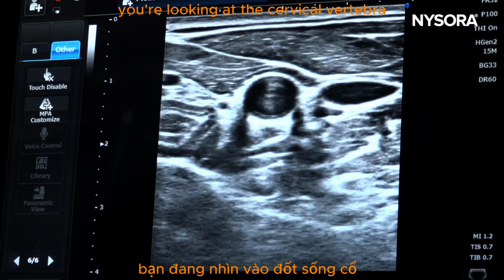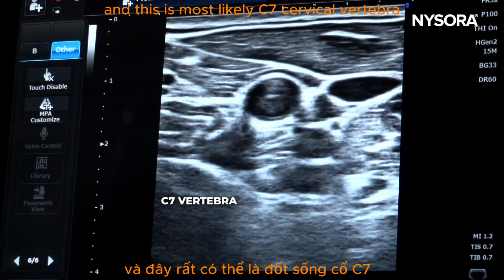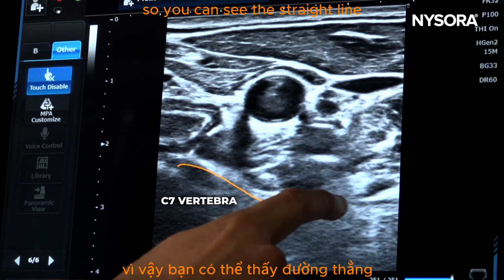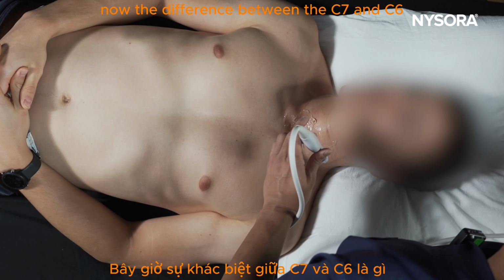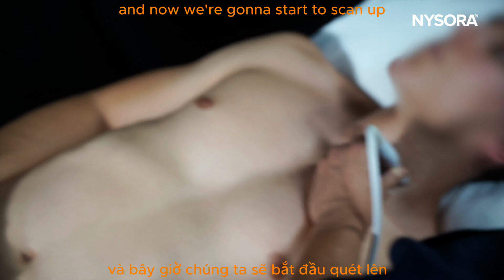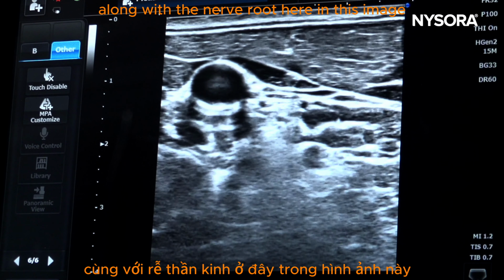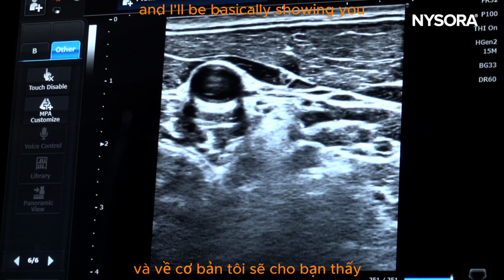which will tell you you're looking at the cervical vertebra, and this is most likely the C7 cervical vertebra, because at this level you don't have the anterior tubercle, so you can see the straight line and you can see the posterior tubercle. Now the difference between C7 and C6: C6 has an anterior and posterior tubercle, and now we're going to start to scan up, and now we can see the anterior and posterior tubercle along with the nerve root here in this image, and I'm going to freeze this image and I'll be basically showing you.